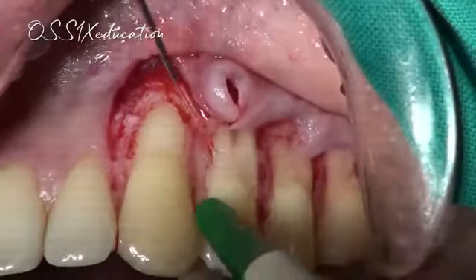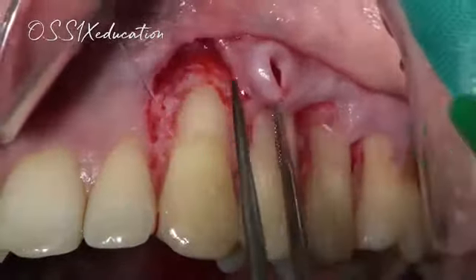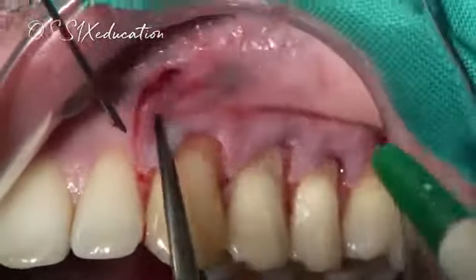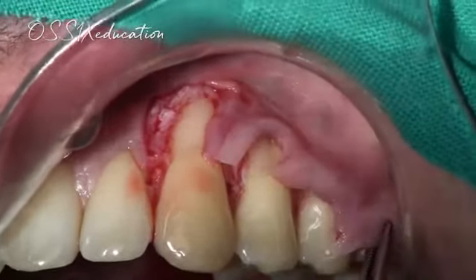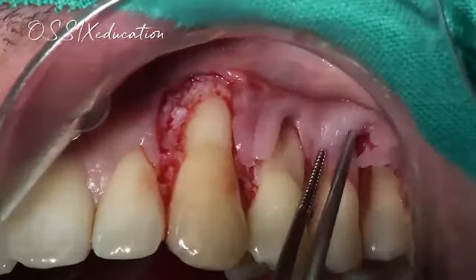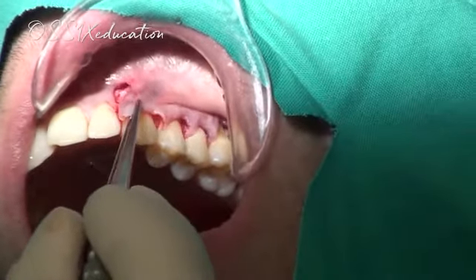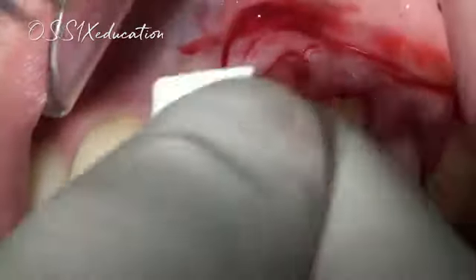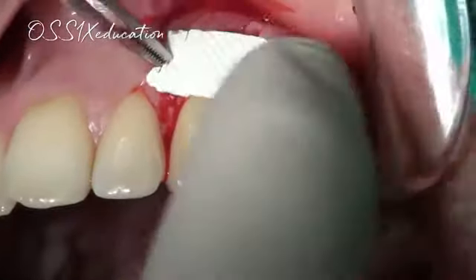Alright, and now the flap is fully prepared. And I'll show you what I mean. Okay, you see, I can move it really significantly in a coronal position. Okay. And now we will start to adapt the volume.